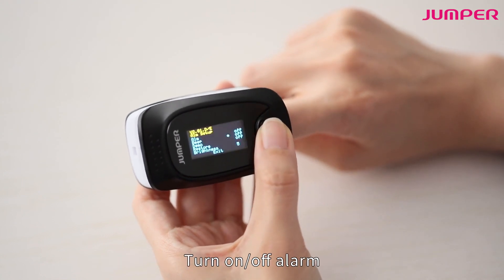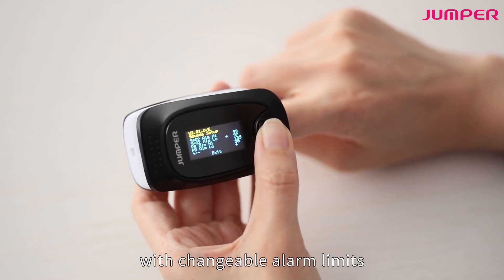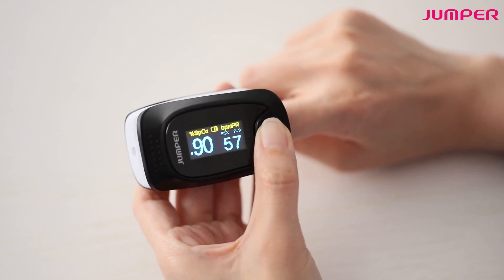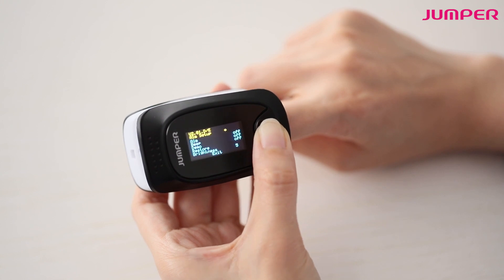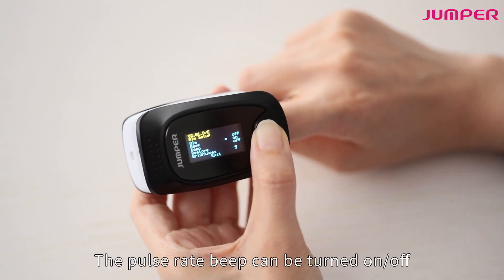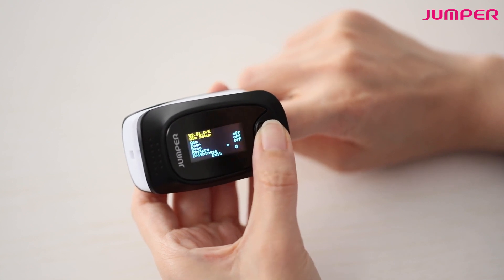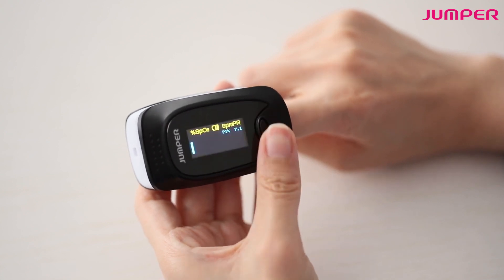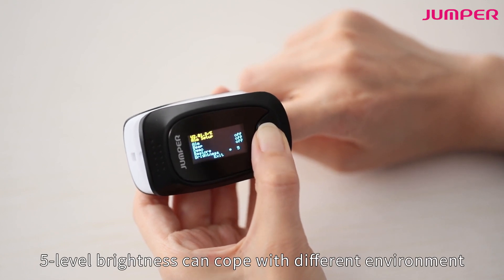In settings, you can turn the alarm on or off with changeable alarm limits. The pulse rate beep can also be turned on or off. Five levels of brightness can be adjusted to cope with different environments.